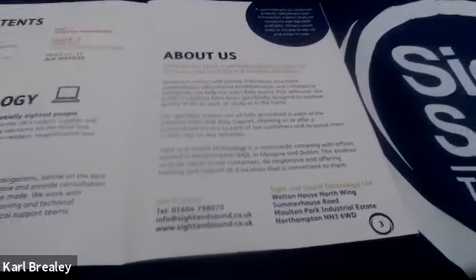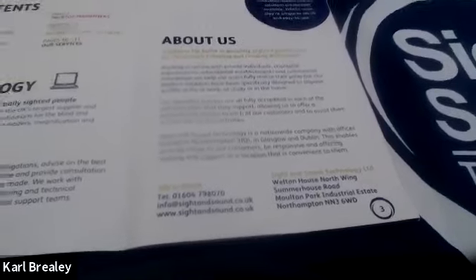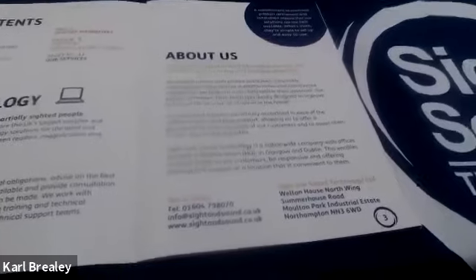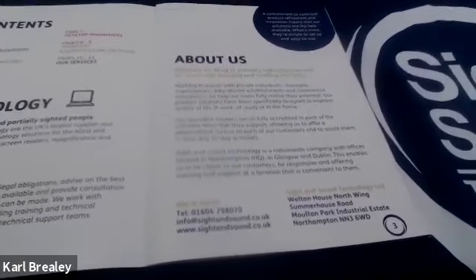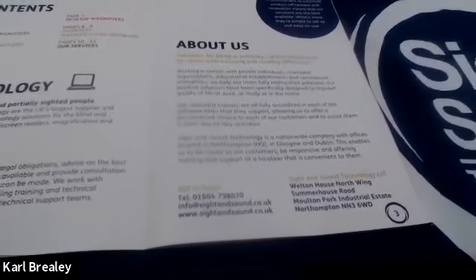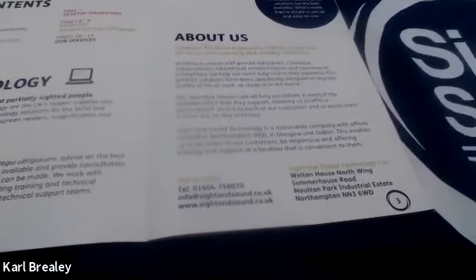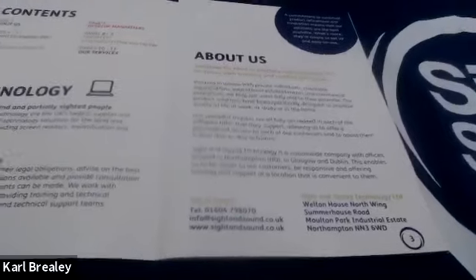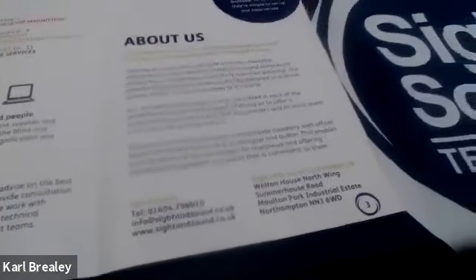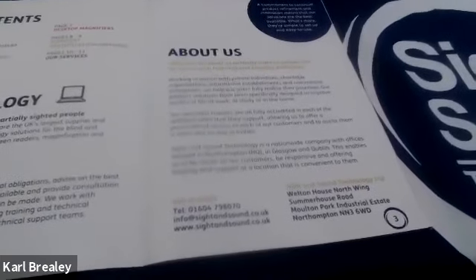Whenever I've done a setup, because all of these devices, just for your information, are hand delivered at the moment and you're trained on there and then when they are delivered to you, I make sure this lanyard is connected and I won't leave unless it has been. So you might have me there for 10 hours until I manage to persuade you. But generally, before I get there, I set it up and I've already got the lanyard connected.